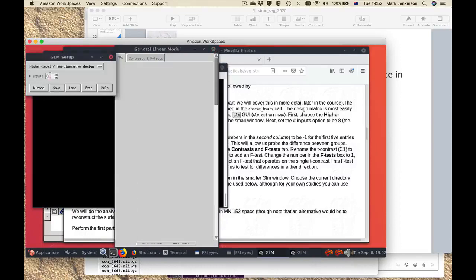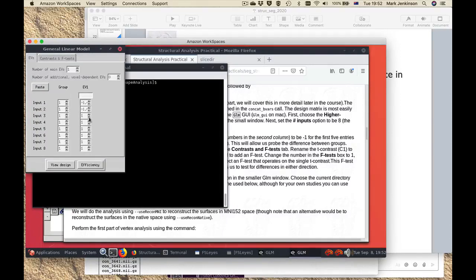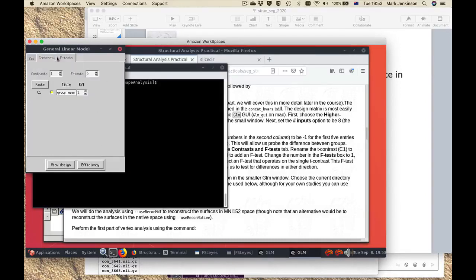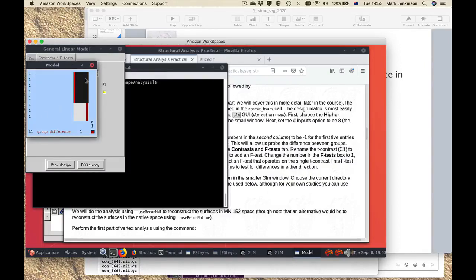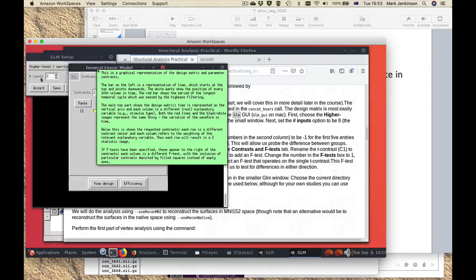We're going to change the number to eight because we've only got eight subjects. We change the first five — our controls — so they have a minus one for the modeling, and a plus one for the next three. This column we leave as all ones because that models group variance, considering they all have the same group variance. This allows us to model the difference between the means of the two groups. Then we set up some contrasts: one F-contrast and one T-contrast, which we'll call group difference. As I said, if this doesn't mean anything to you at the moment don't worry — we will cover this in great detail later on.